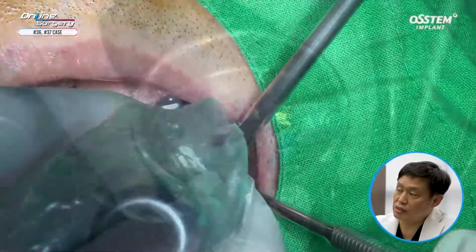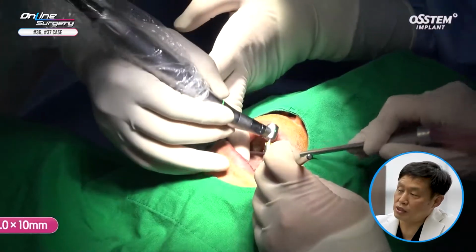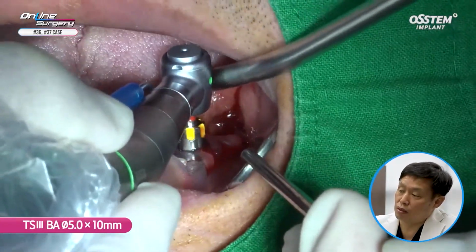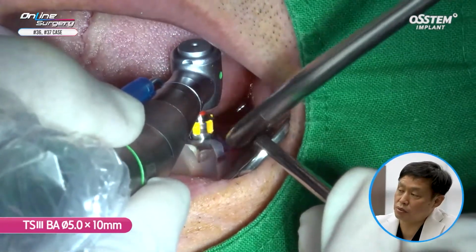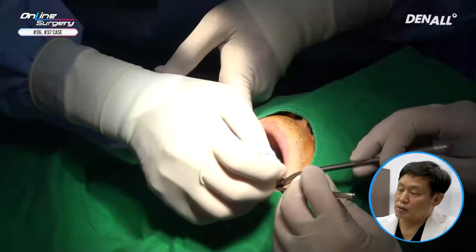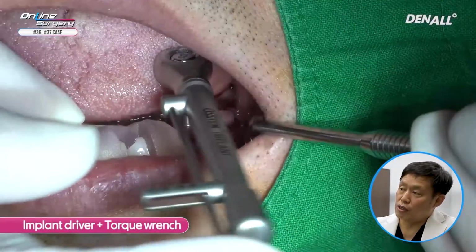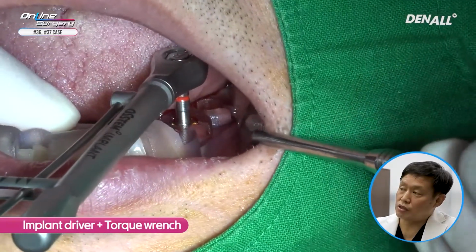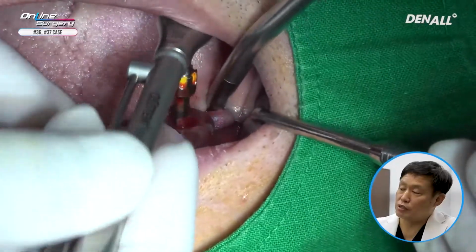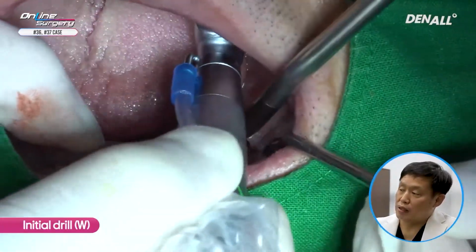Next, the TSⅢ 5.0 is used. This is BA surface, hydrophilic surface. You irrigate it sufficiently before implant placement. The engine is used to place it about 80%, and then torque wrench is used to find the correct position. In this case, I didn't do it this time around because we're taking film, but if you put your finger and press it, you'll be able to get implant position in a more stable manner.